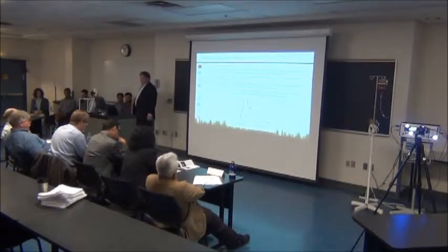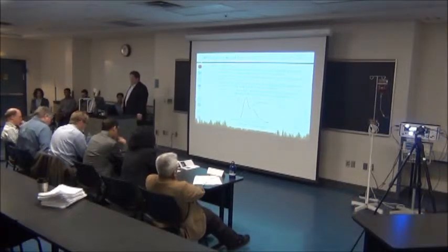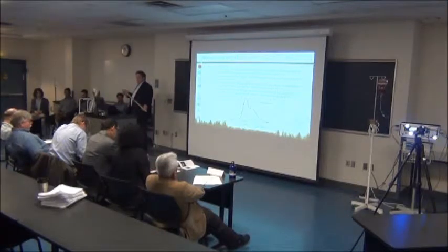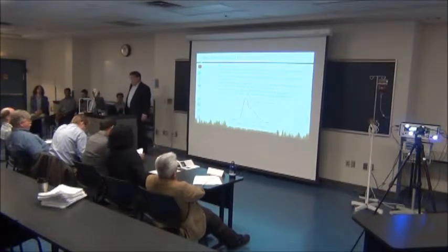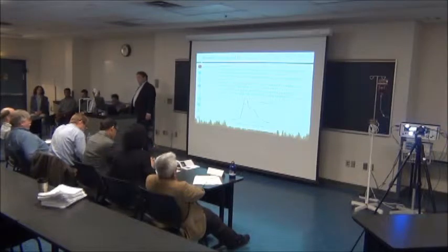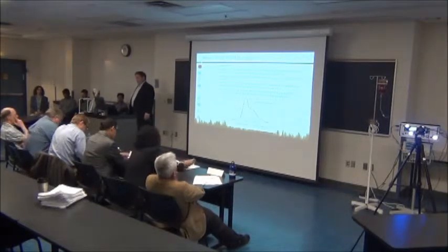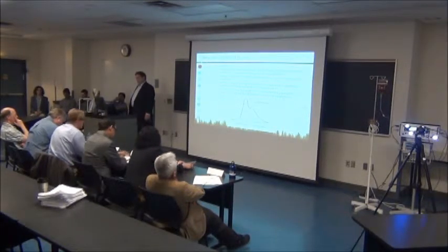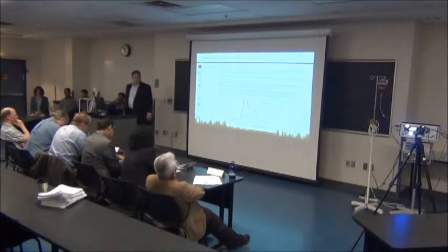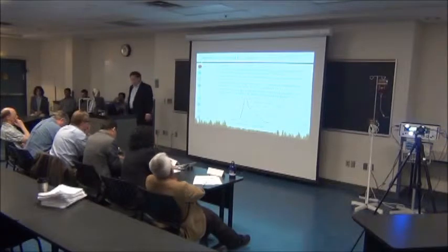Why invasive blood pressure? Accuracy, it's dead accurate. Continuous beat-to-beat monitoring for patients who are likely to display sudden changes, for example in surgery. It allows blood pressure readings at low pressures, in shock patients. The trauma of repeated cuff inflations is avoided in patients who need close long-term monitoring, like in ICU. The shape of the trace can be interpreted by eye for diagnosis or by a specific device. It can be analyzed by a computerized device.